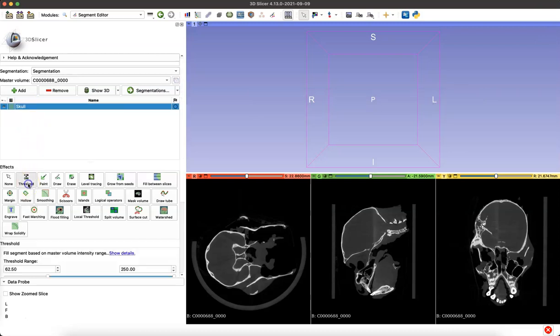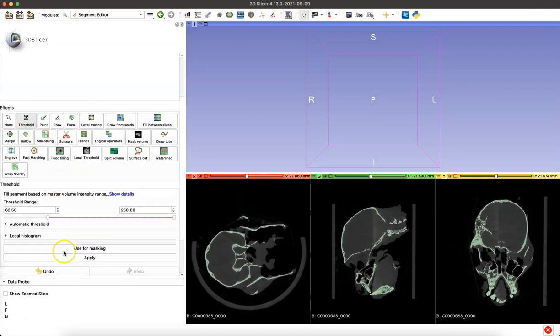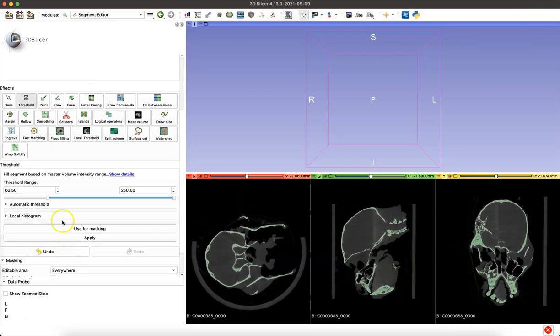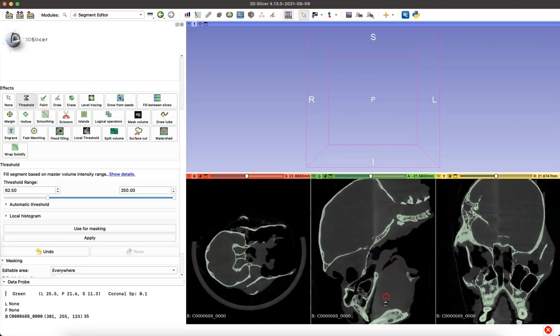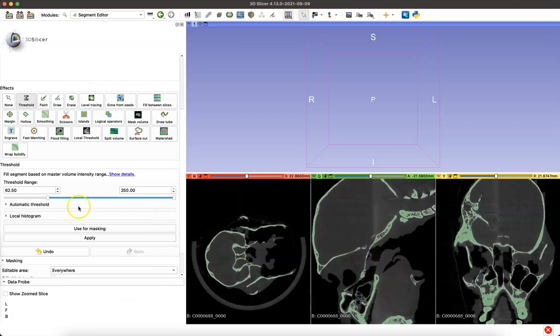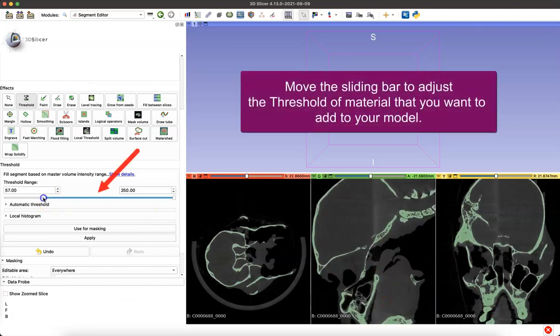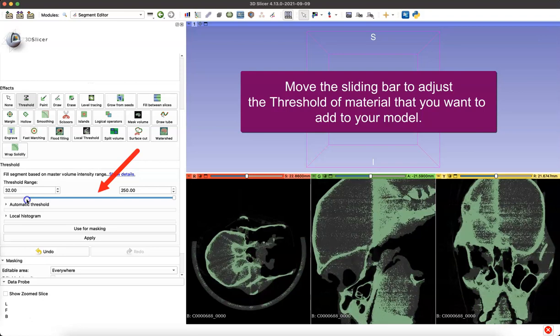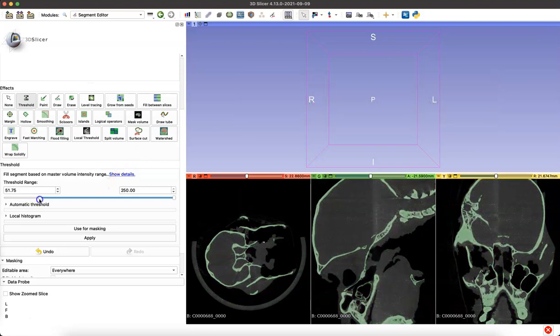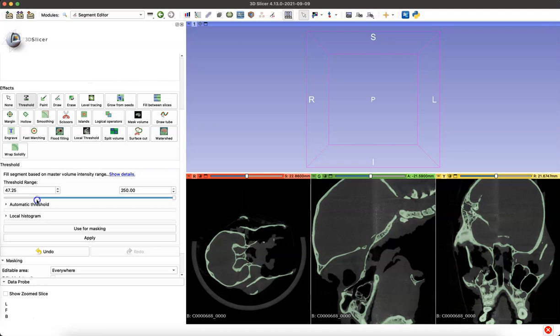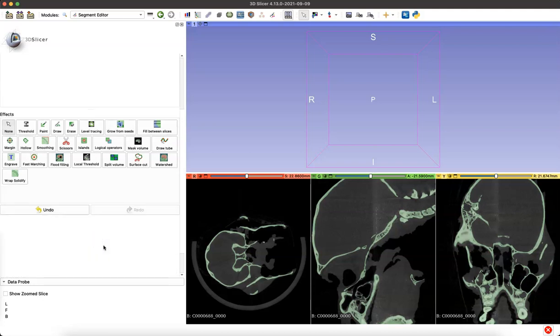First thing we need to do is set a threshold for the material from our volume that we want to put into that segment skull. If you're dealing with something with really thin bones, I'd suggest zooming up so that you can move that sliding bar and make sure that you're capturing those thin bones when you set your threshold. Right now you're choosing what material to add into that segment, and then you click Apply.